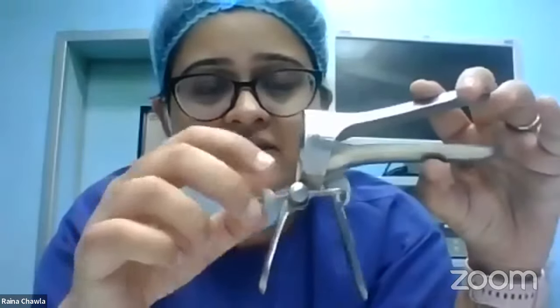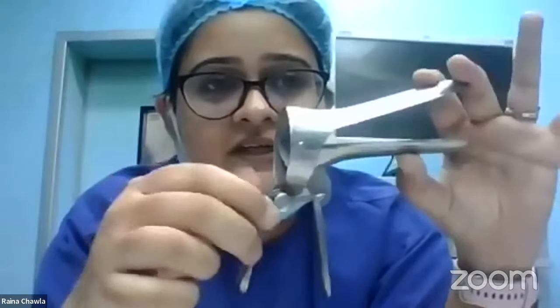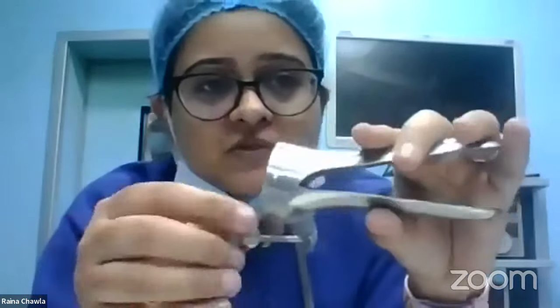Another advantage is it is self-locking. You can see the lock here. Once I open it up and I put the lock, it stays in place. So I've locked it. Now my hands are free and I can do other procedures. So this is a Cusco speculum.